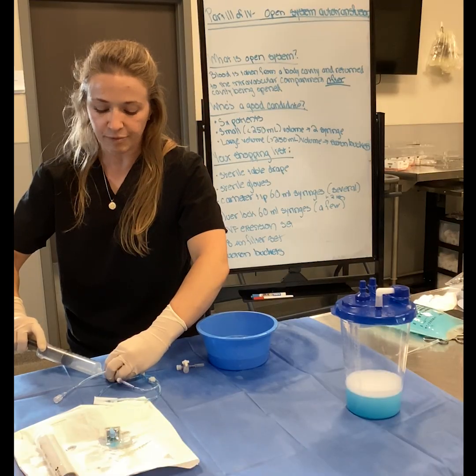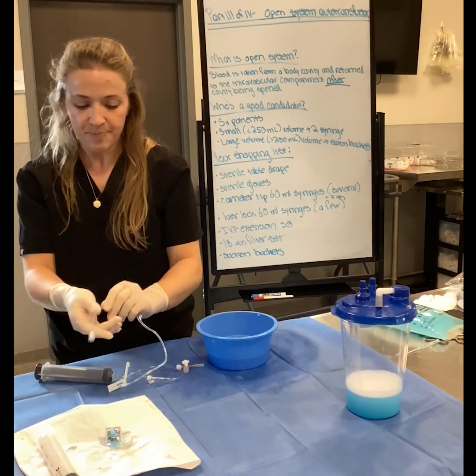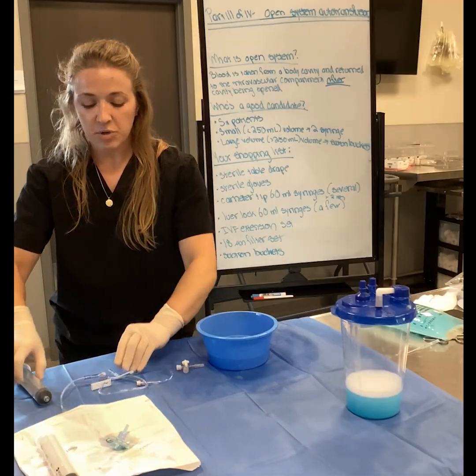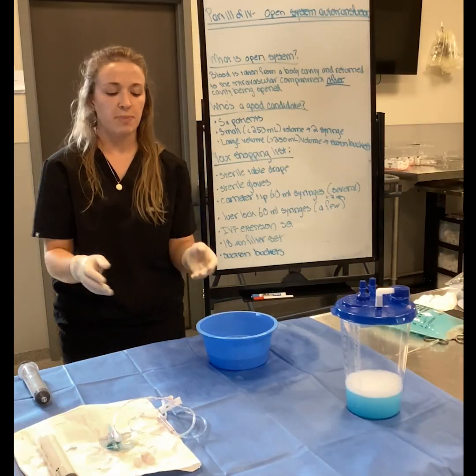If you think they're going to have liters and liters of effusion, this is really what you want, because all you need to do is ask the surgeons or the doctor to get that fluid into the bucket, and then you can close up the bucket. And kind of gradually, a bit at a time, you can take that fluid and give it back to the patient.